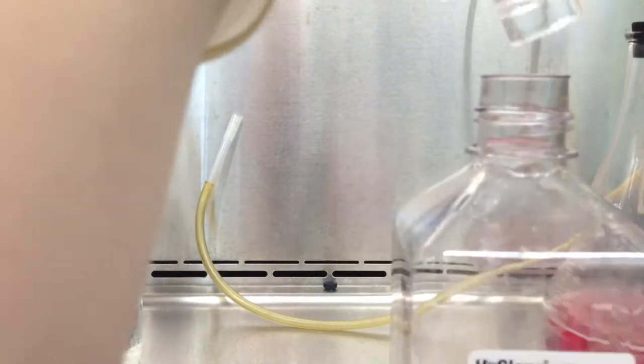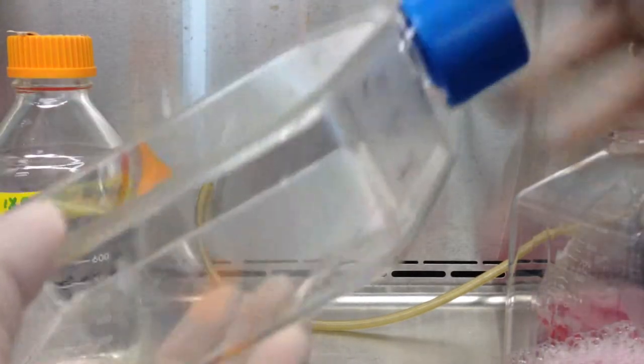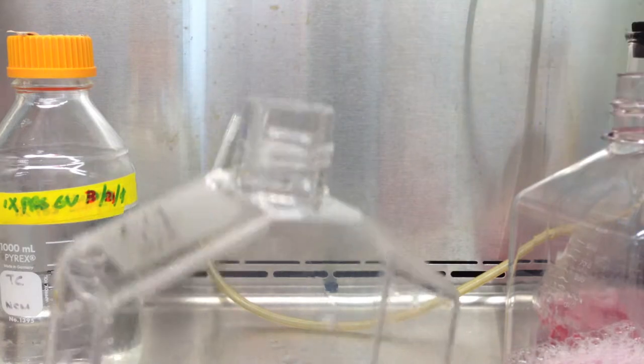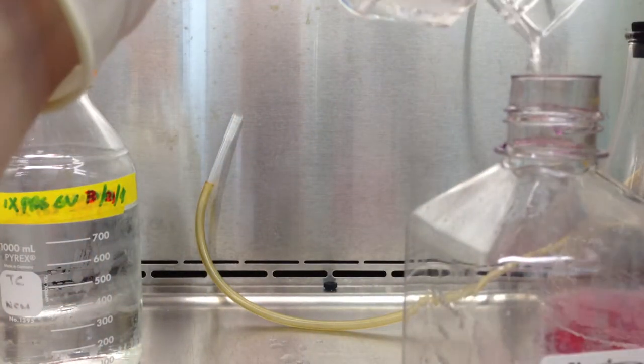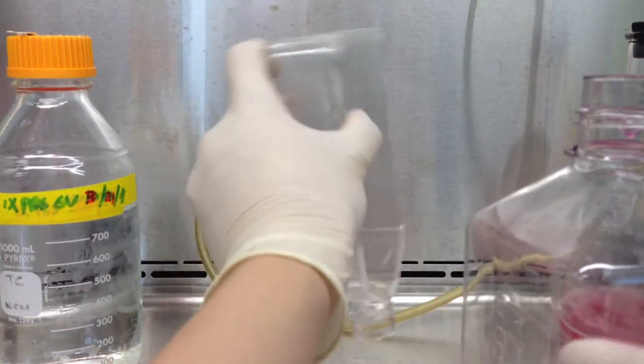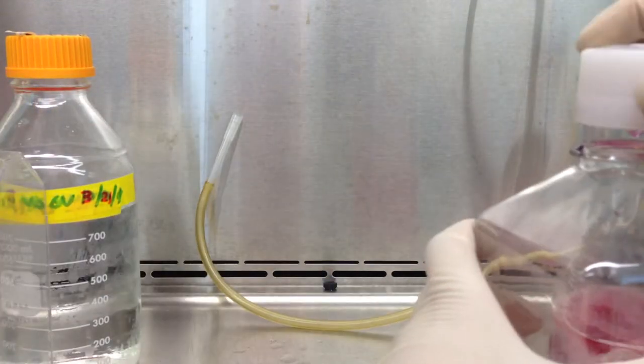And if there's still some left over, I just dump it on the hood, and I use ethanol and a paper towel to clean it up. Although, I guess that depends on your type of cell, if it's hazardous or not.